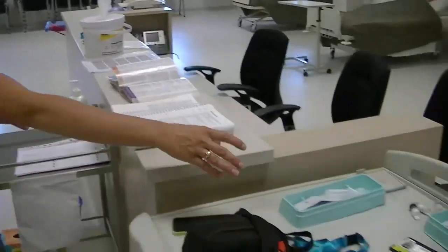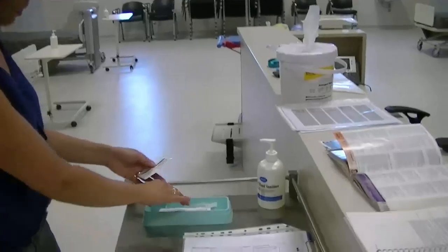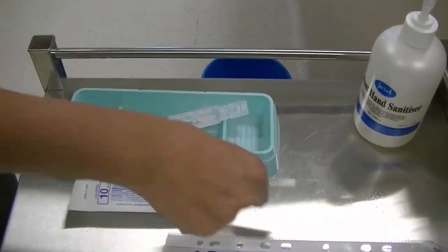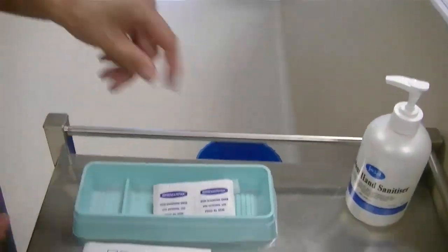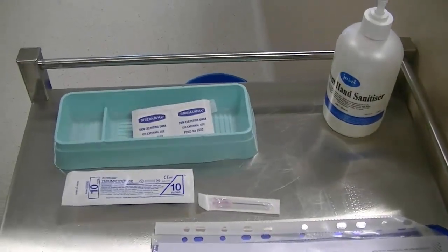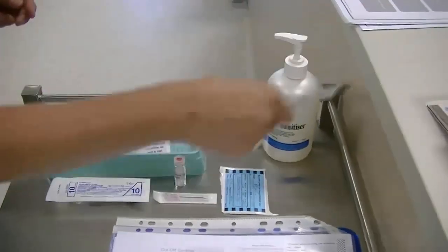I also have my 10ml syringe, a needle to draw up with, some water to dilute the drug with, some swabs, and I need the drug, which will be ceftriaxone. The other thing I need is a label, a pen.